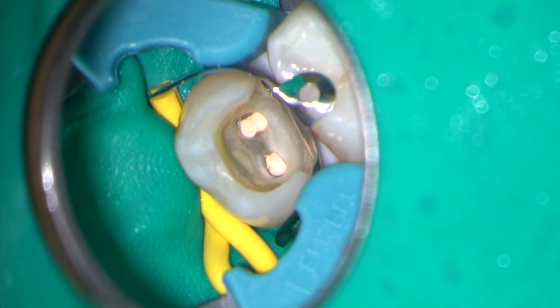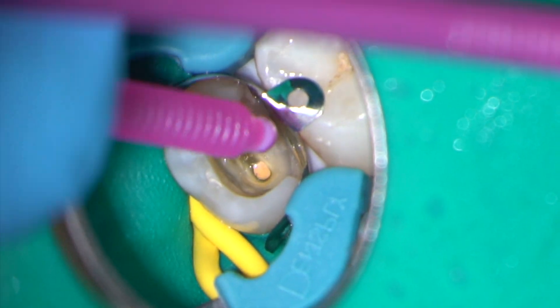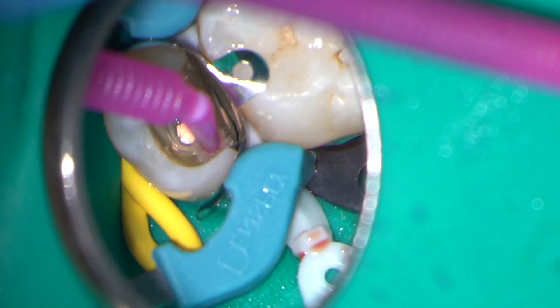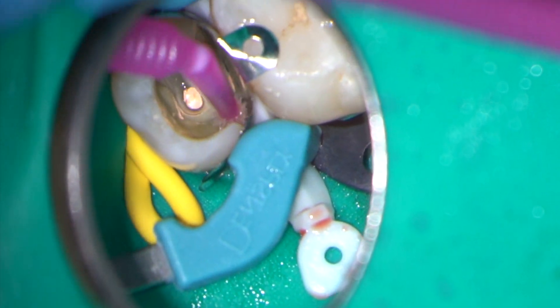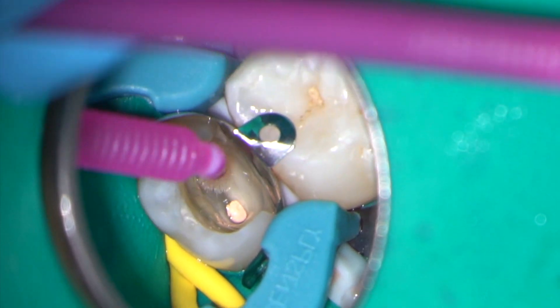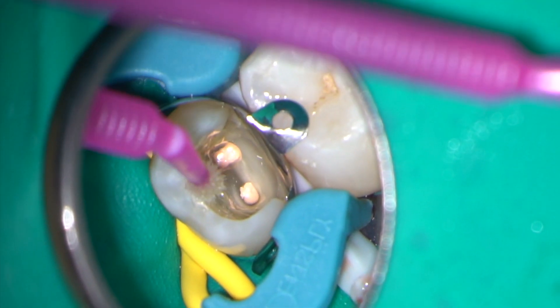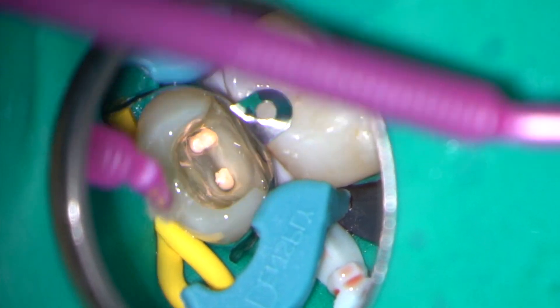The access cavity and tooth were completely restored using composite. Here I've placed a Palodent matrix, tooth separator and wedge to get a good interproximal contact. The flowable bulk fill composite, SDR, was used across the pulp floor to fill the majority of the space. The top was then restored using a light-cured composite.